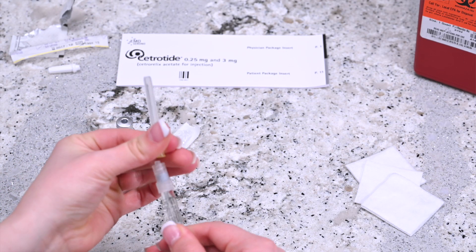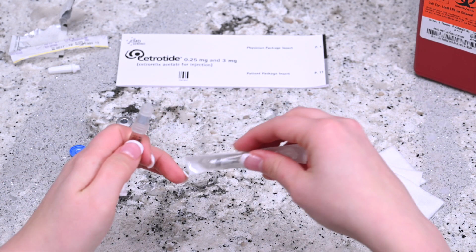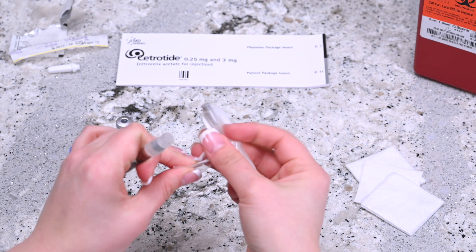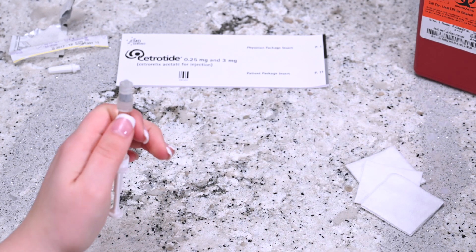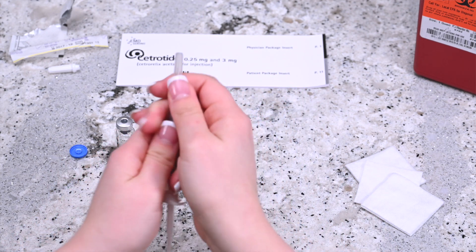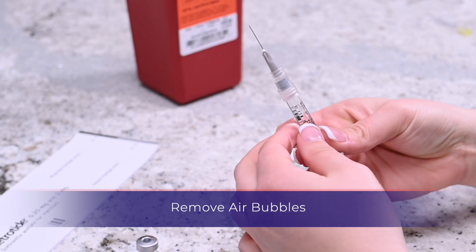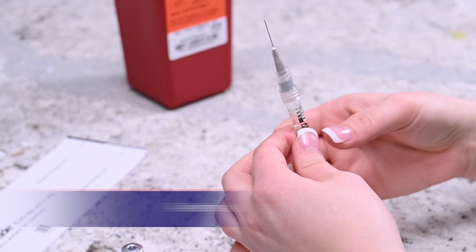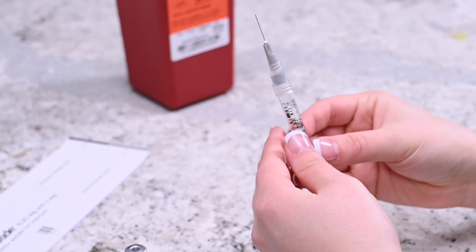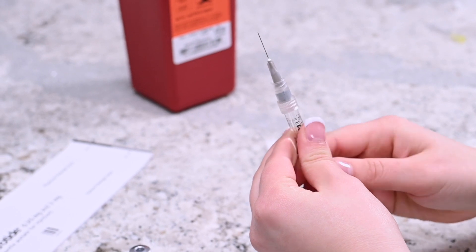Detach the needle and dispose of the mixing needle into the sharps container. Remove the 27 gauge three-fourth inch needle for injection from its packaging and twist it onto the syringe. Remove the cap. Holding the needle upright, gently tap the side of the syringe until the air bubbles migrate to the top. Apply slight pressure on the plunger until a drop of liquid appears at the tip of the needle.